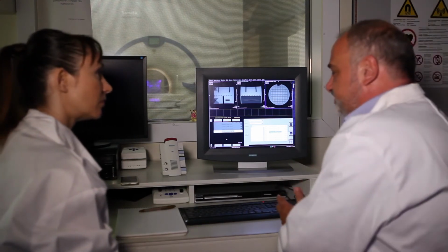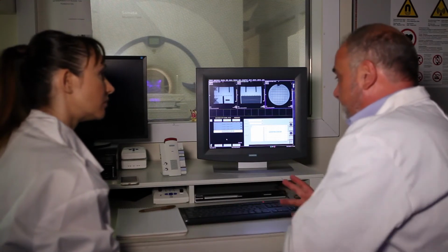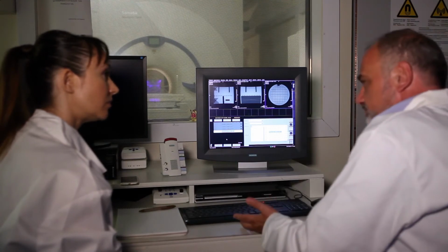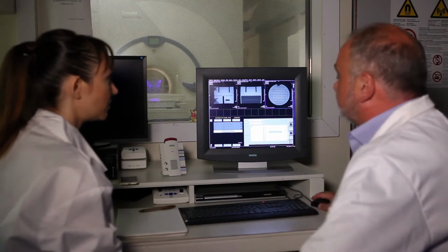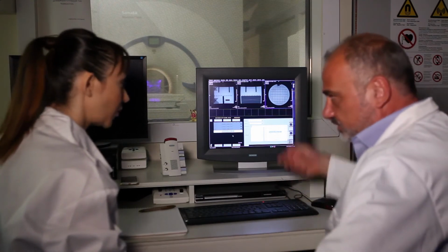Even the specific checks have to be done with the medical physicists like us, with the doctors, physicians, and the technologists. So this is a sort of accreditation in the auditing mode, something which has been done in the States for years now. In Europe, it doesn't exist. So, okay, we can discuss problems as the machine is working.